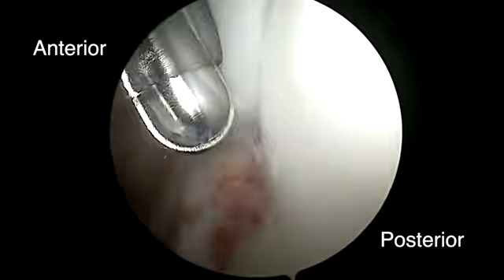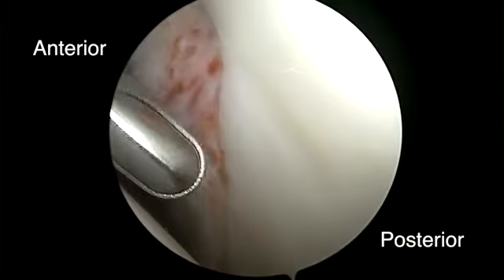The anterior labrum underwent gentle debridement with a shaver from an anterior-superior portal, and the extent of the labral damage is evaluated. An anterior-inferior portal at the upper border of the subscapularis is also made with insertion of an 8.25 mm cannula. The anterior labral tear is then repaired in standard fashion with a 1.8 mm knotless fiber tack anchor starting from the inferior labrum.